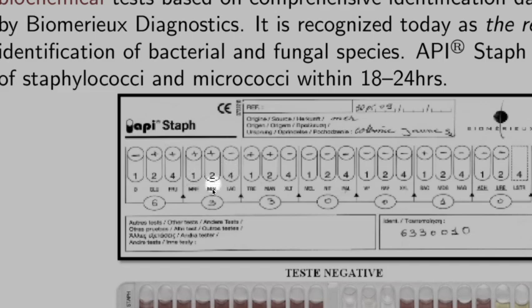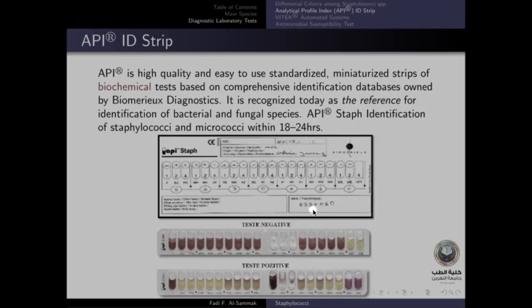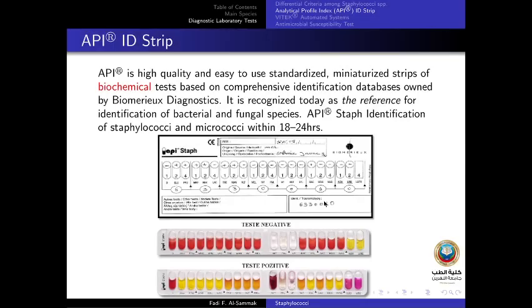So that is 3, and this is the 3 right there. For the third compartment, we do the same, and so on and so forth until we reach that number. We go to the tables, then that's it, we know the strain that we are dealing with.